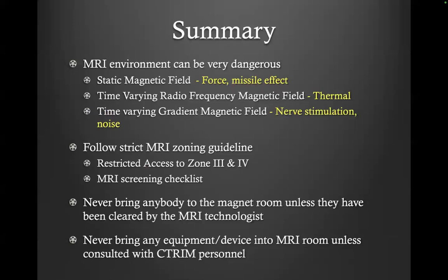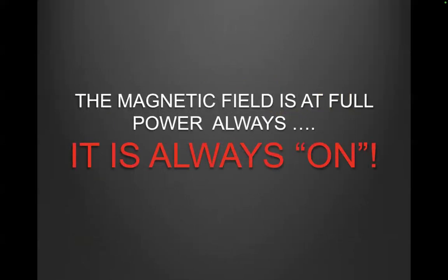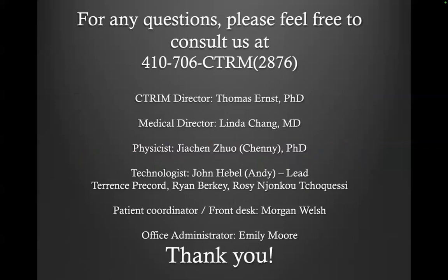So you need to follow strict MRI zoning guidelines. You should restrict access to zone 3 and zone 4, and you should take the MRI screening checklist very seriously. And never bring anyone to the magnet room unless they have been cleared by the technologist. Also, never bring any equipment or devices into the MRI room unless consulted with our personnel. Again, remind for the 1,000th time, the magnetic field is at full power always, and it is always on.